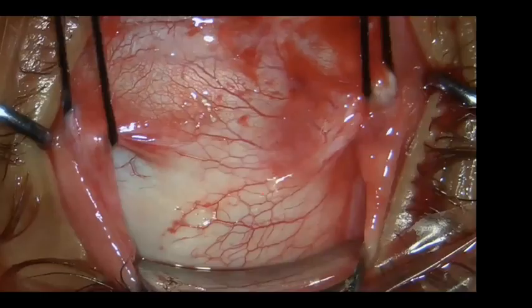At the time of the surgery, these are some surgical tips. I need to open the conjunctiva. I open a large incision of the conjunctiva extending from the superior rectus to the lateral rectus if I'm going to operate on the upper temporal quadrant, which is the majority of situations. And I usually adjust my microscope so that I'm facing this quadrant, which makes the work easier for me.